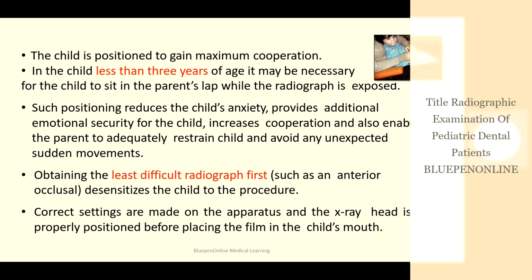Also obtain the least difficult radiograph first, such as an anterior occlusal. This will desensitize the child to the procedure. Correct settings are made on the apparatus, and the X-ray head is properly positioned before placing the film in the child's mouth.